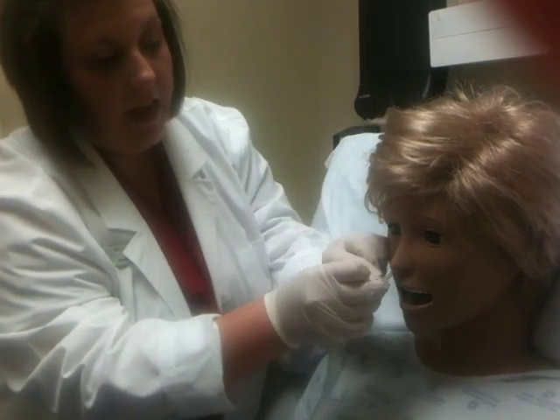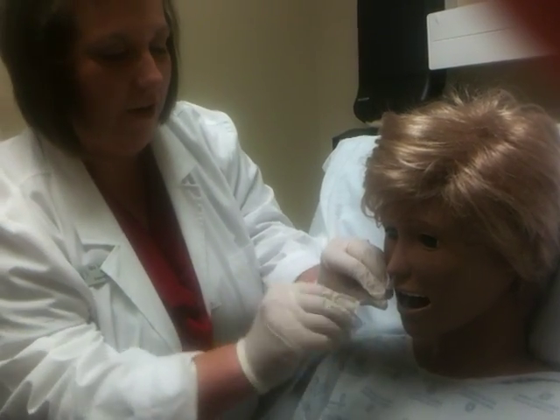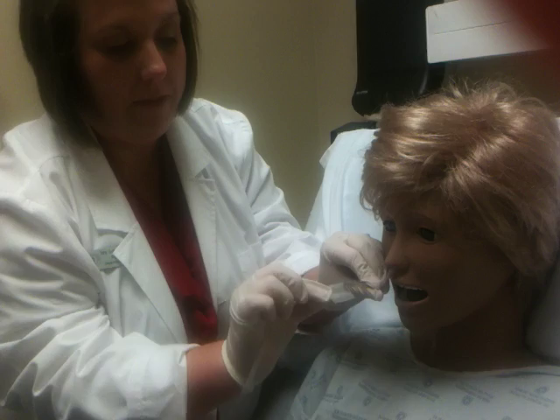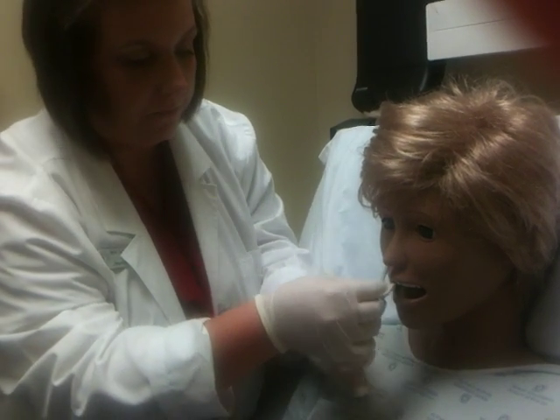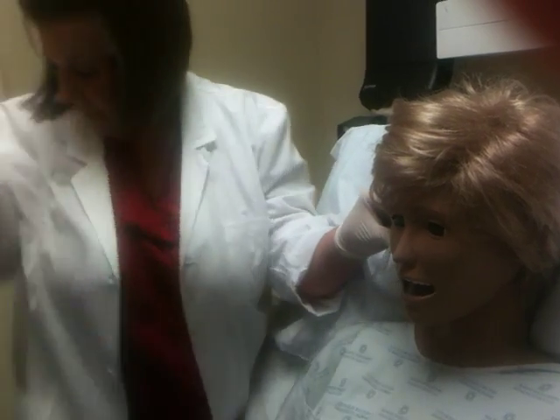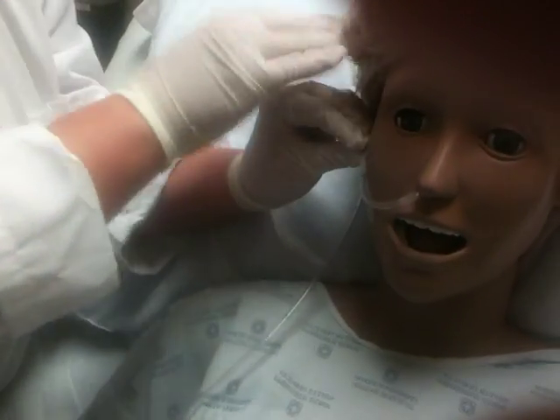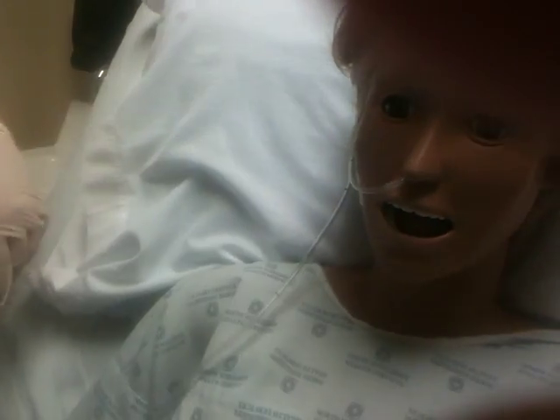Right, and I would advance it until my measurement. But on the mannequin, it won't go any further. So I would advance it to my measured mark, okay? Once I got it there, I'm going to temporarily secure it to my cheek, because I don't want to permanently secure it until I check placement, okay?